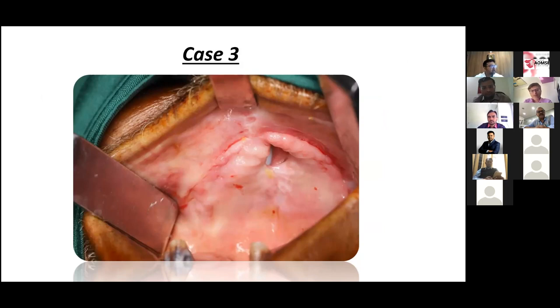Sir, because there is a lot of fibrosis here, this is secondary. Cleft palate cases are primary. Okay, so you are right, there are chances that if you do only this, it might open. But if you are anyway doing only a palatal prosthesis, in the sense you've already put zygoma implants and are doing a prosthesis there, we're not bringing any foreign tissue. The only option left is rotation. So you'll have to rotate this and see how it stays there. There are chances it might open. There are chances it might stay, as it does in cleft.